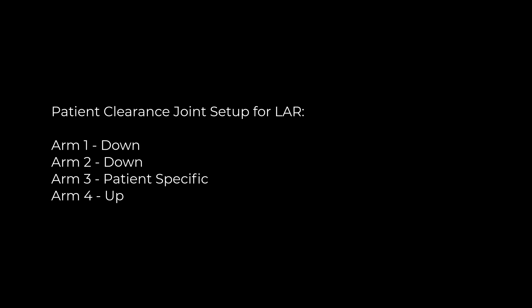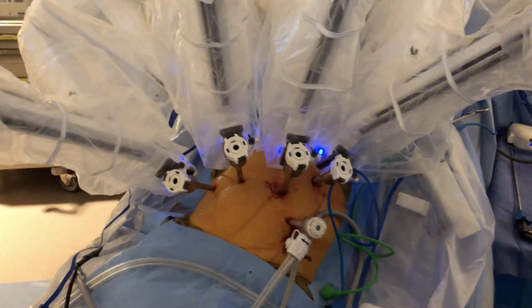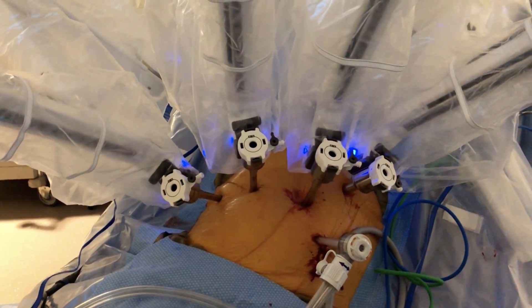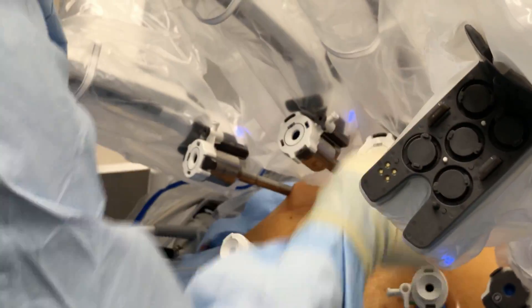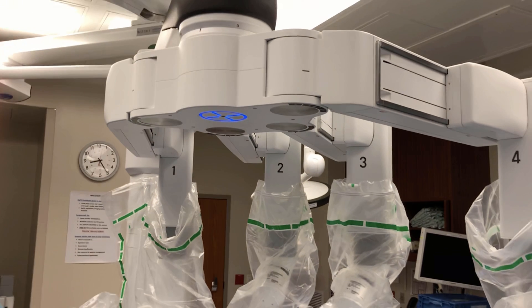That top-down approach goes: laser, then flex joints, then patient clearance joints. The very next thing I do is look at the actual ports themselves — burp the ports and take any tension off the fascia. The very last thing I do is clear the nozzles of the port to ensure I'm not going to rub the patient during the operation.